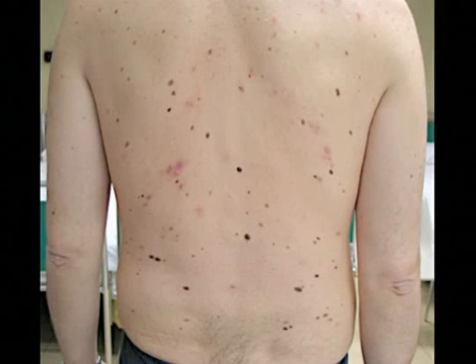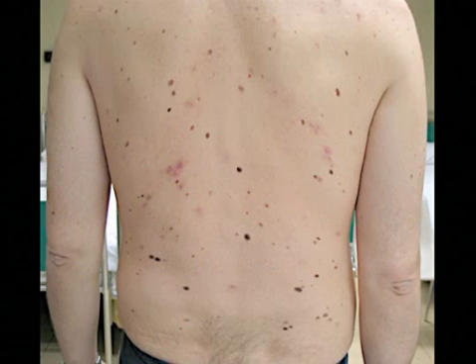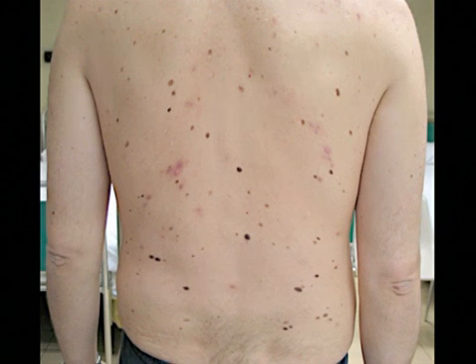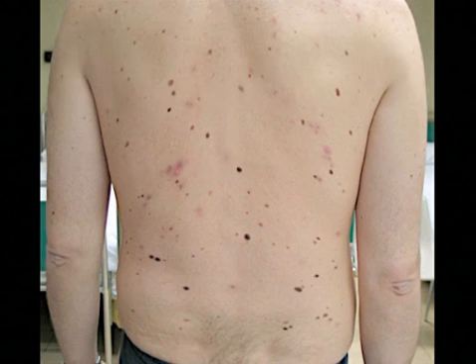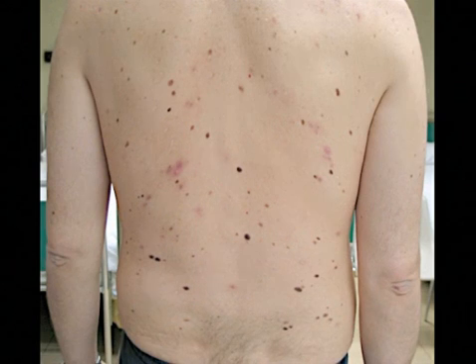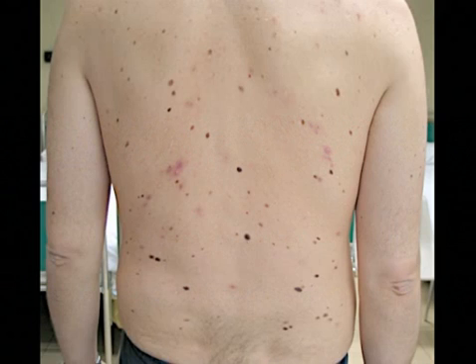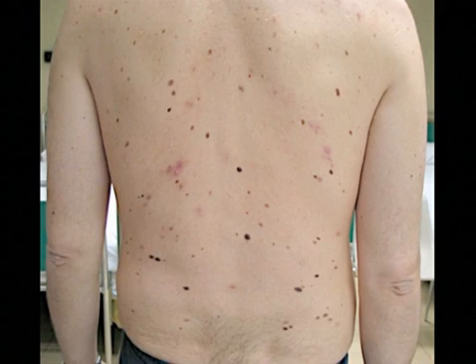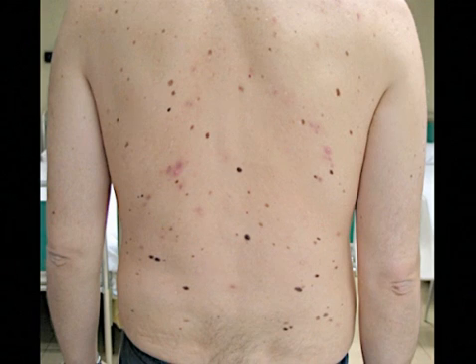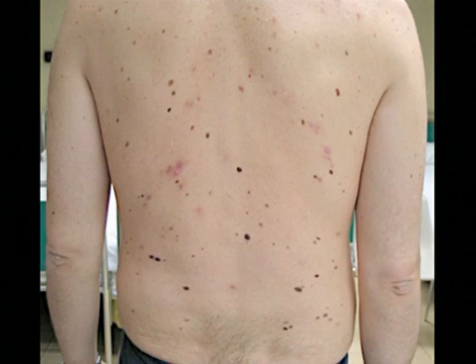In the previous examples, we analyzed lesions with clear-cut differences in terms of network. In real life, and especially in patients with multiple nevi, it is very frequent to find lesions with variable degrees of network irregularity. The point is that to set the right threshold between typical and atypical network is a matter of experience. At the beginning of our learning curve with dermoscopy, we are prone to consider atypical a much higher number of lesions. As soon as we improve our knowledge of the many phases of benign nevi, our gray zone decreases and a better threshold between normal and abnormal is found.